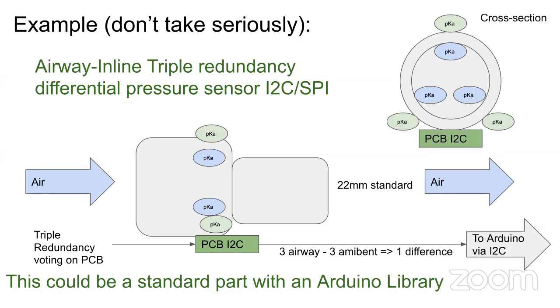pressure sensors. And in breathing, what's important is not the absolute pressure or the atmospheric pressure. It's always the pressure relative to the outside ambient air. So the tube, which is going down the throat of the patient, inside that, the pressure is different than the pressure outside. What you really want is something which would reliably measure that. And unfortunately, sometimes those things get wet due to condensation. Sometimes the patient vomits, other things can happen.